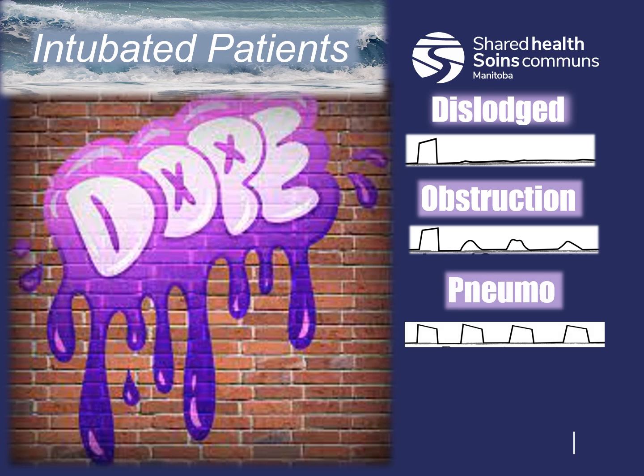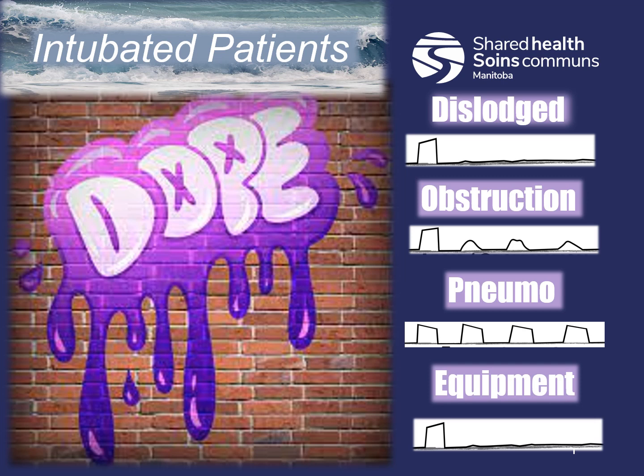Pneumothorax: a change to the waveform. Is there a pneumothorax happening? The mechanical function of the lungs is decreased, so let's take a listen to those lung sounds and see if we can hear anything. And then equipment. Is our end-tidal CO2 sampling line still plugged in? Did we turn it on, or did somebody accidentally turn it off? And if in doubt, remove the tube.